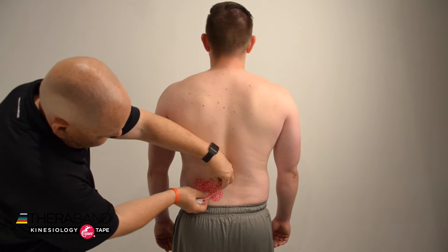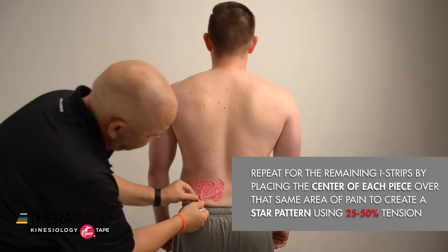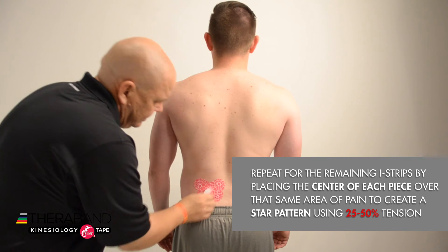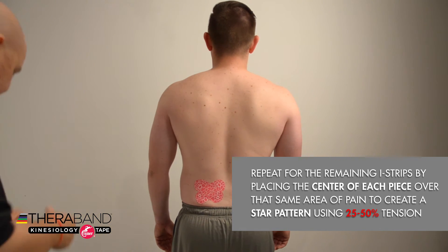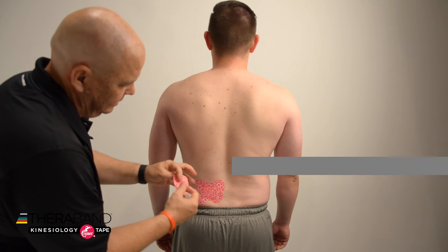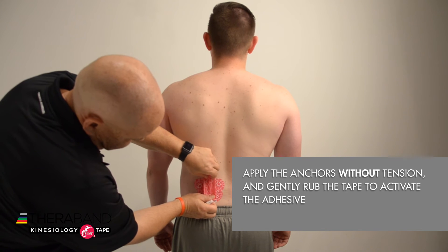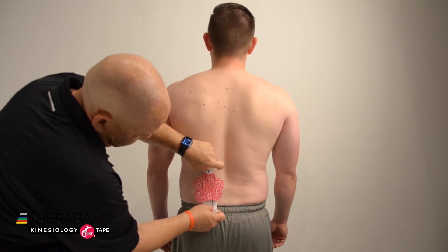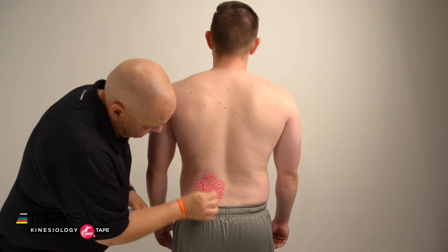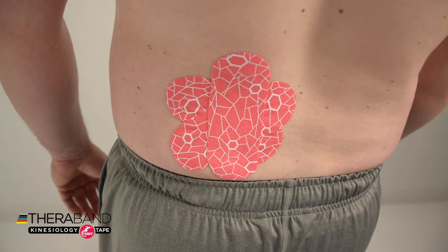We're going to repeat that process with the remaining eye strips by placing the center of each tape over that same area of pain to create a star pattern, using about 25 to 50% tension in each piece of tape, and then rub the entire tape application to activate the adhesive. There we have our Lumbar STAR pattern for Low Back Pain.